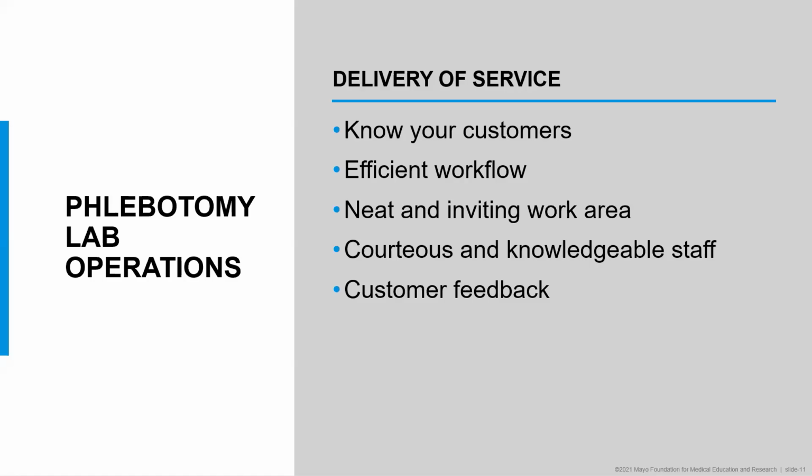Part of delivery of service is also having a neat and inviting work area. We talked about patients being one of our customers. When patients come to your work area for phlebotomy service, we want to make sure they find a very neat, inviting environment, so that they are comfortable when they come.